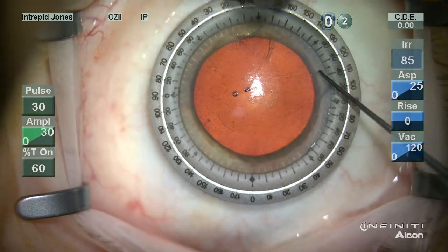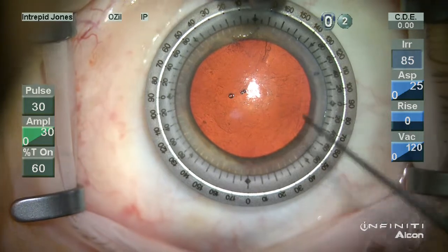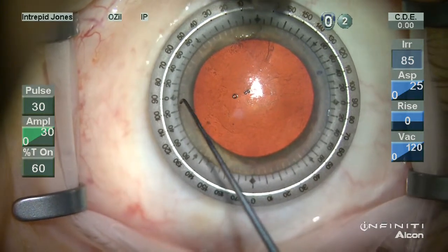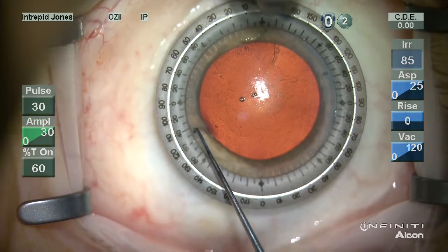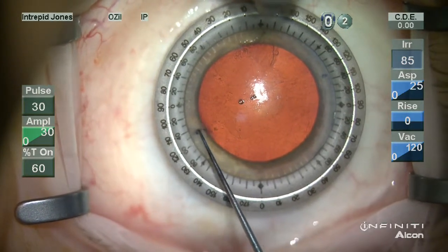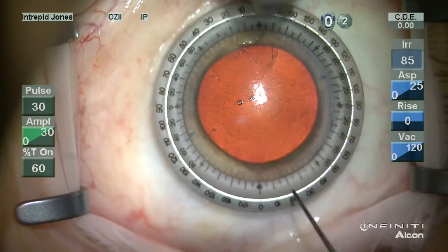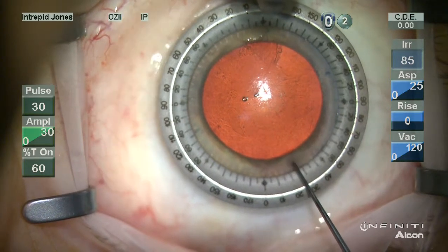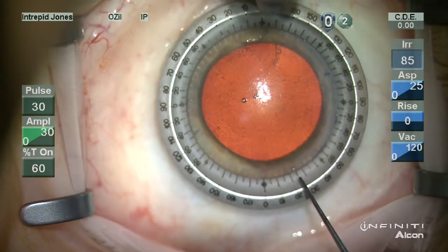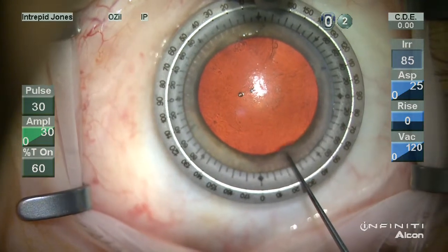Using the same Sinskey hook, I'm going to denote the 115 degree axis. That can be read on the outer bevel of this reference ring. And I also ensure that I have proper placement of my main wound with a mark as well at 25 degrees, so it's 90 degrees off from our intended relaxing incision.